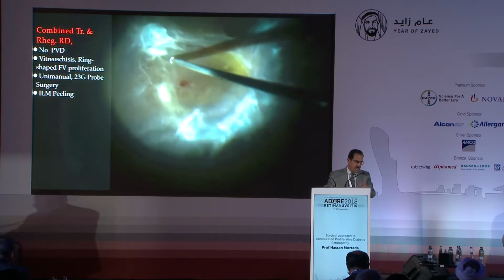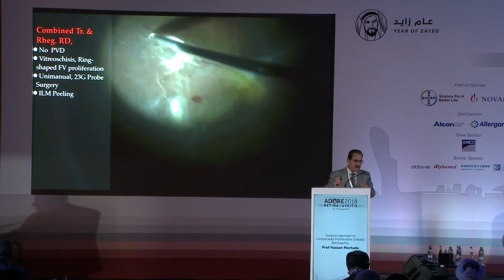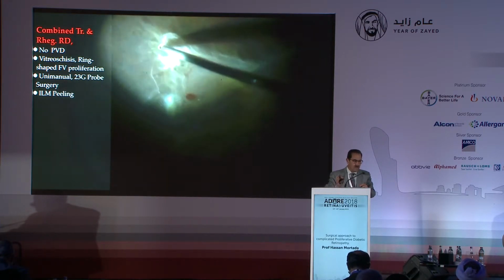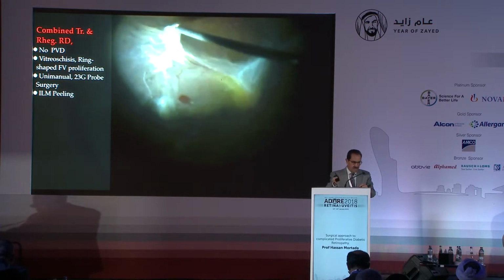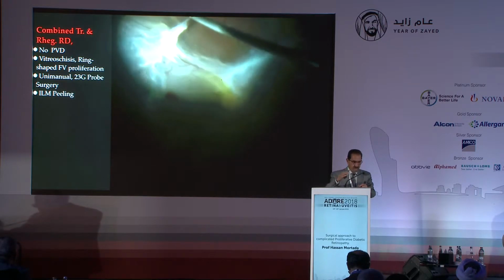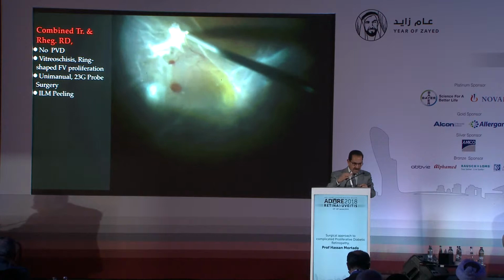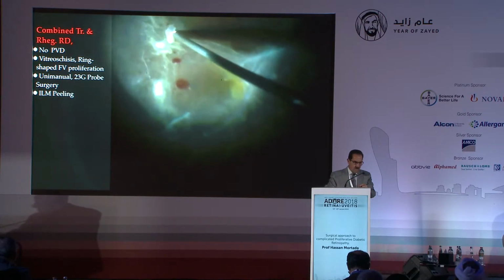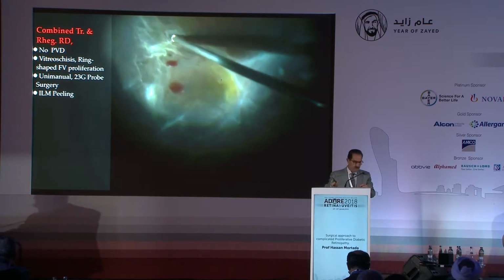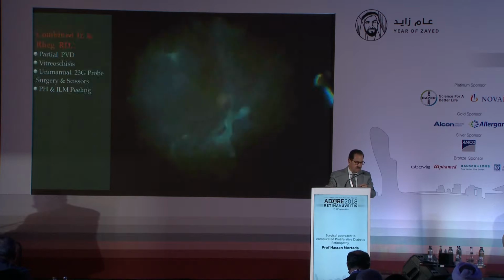Until, and this is the peripheral faint membrane. This is the membrane. And without discovering this membrane, you will not be able to find the cleavage plane from the periphery. So you have to find this thin membrane connecting the edge of the white fibrous tissue to the periphery. And this is continued until the whole fibrovascular tissue is removed.